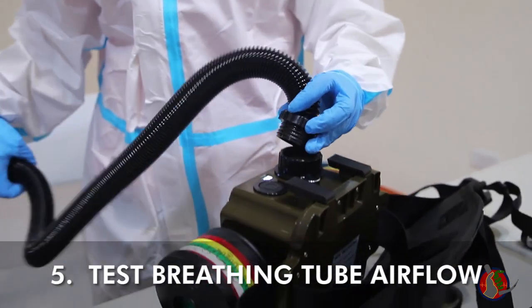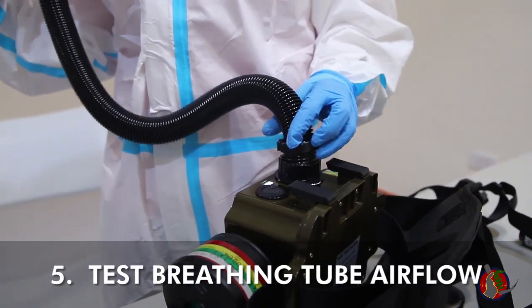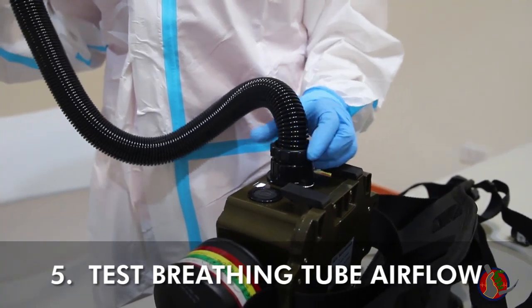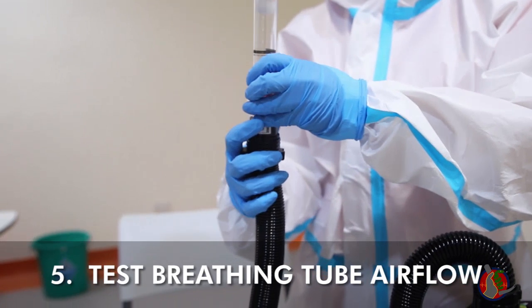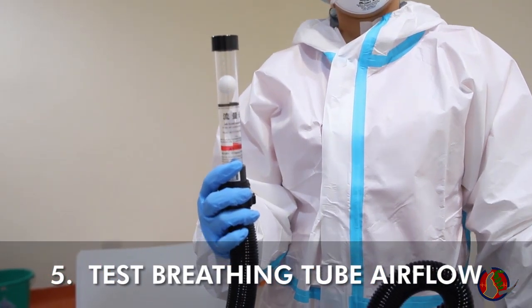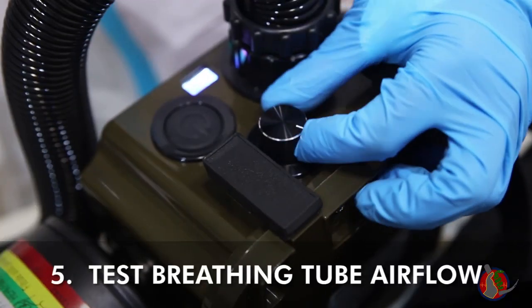Attach the breathing tube to the body's air outlet, then repeat the airflow test, attaching the airflow indicator to the breathing tube's outlet and watching the ball rise up above the pass mark. Adjust the regulator accordingly.